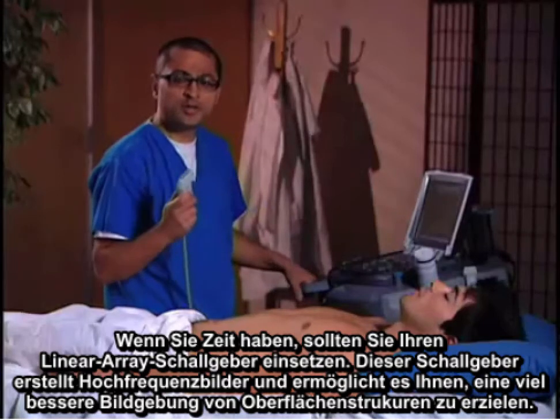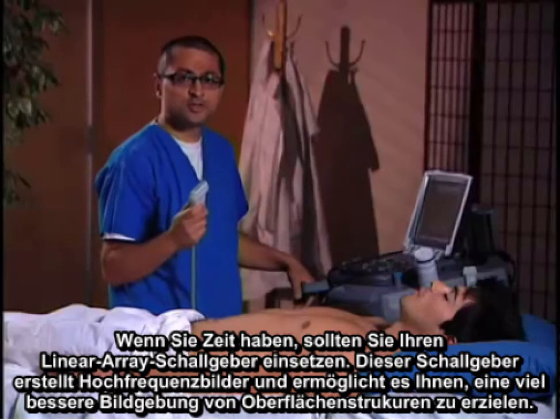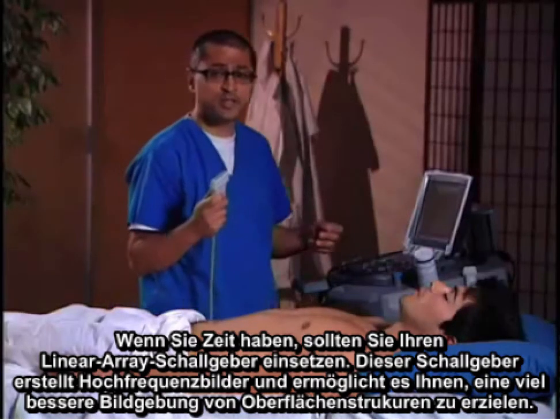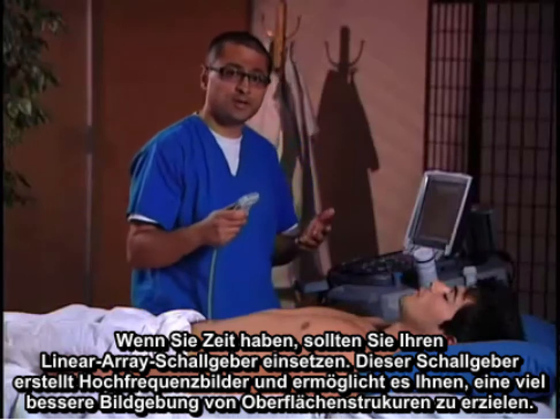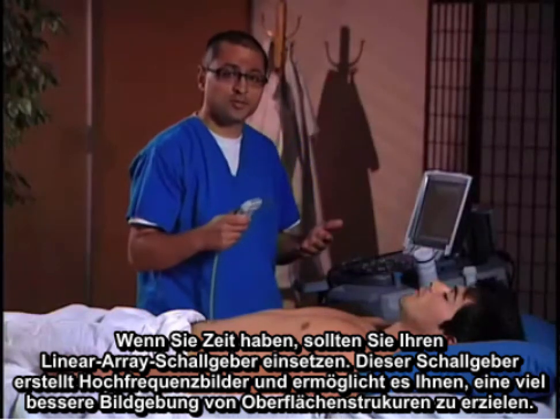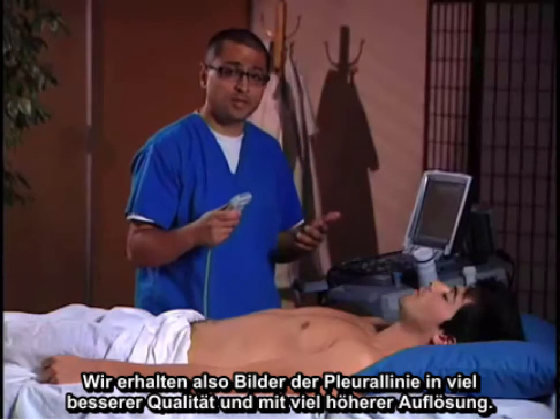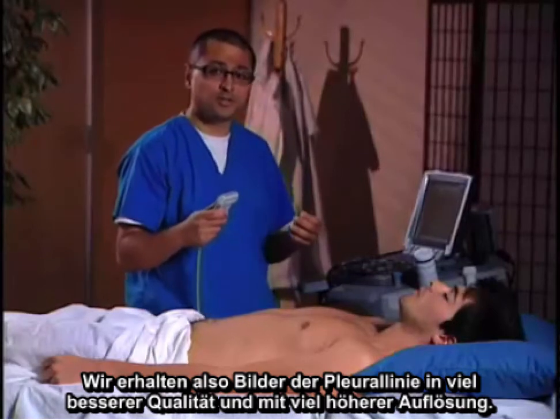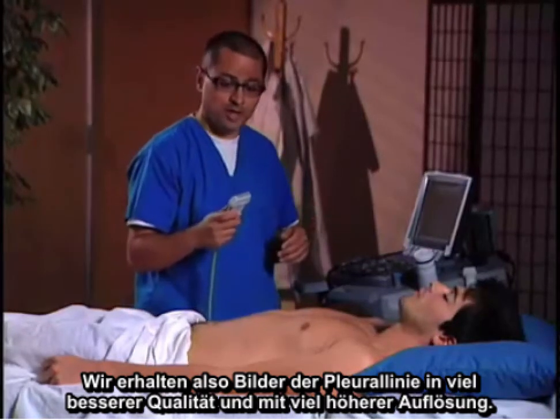If you have time, you want to use your linear array transducer. This transducer does high-frequency imaging and allows you to do much better imaging of superficial structures. So we're going to get much better quality, high-resolution pictures of the pleural line.